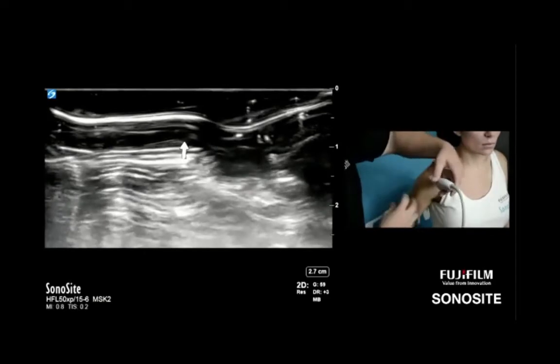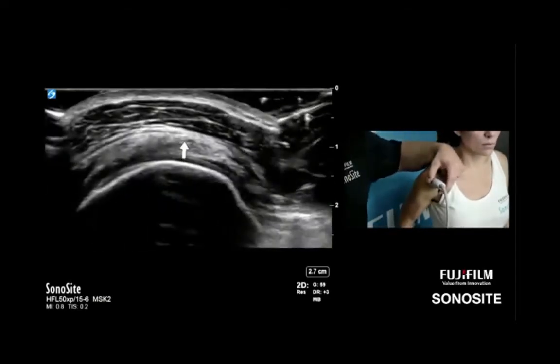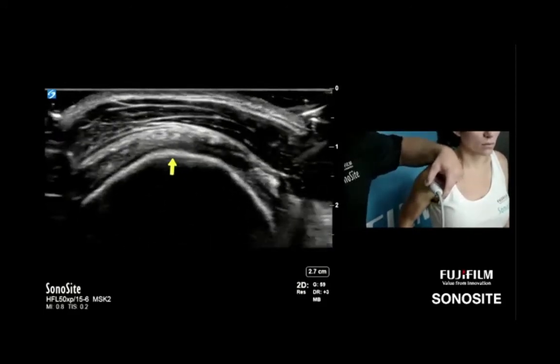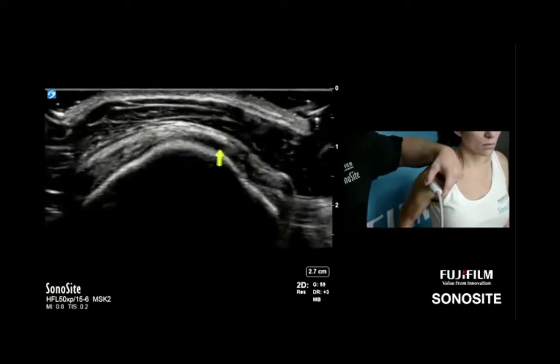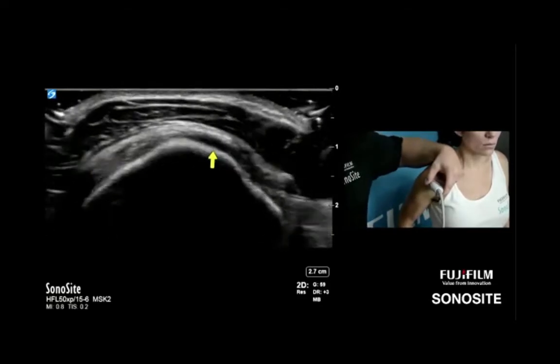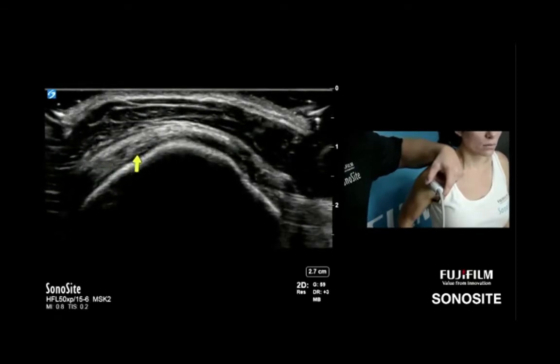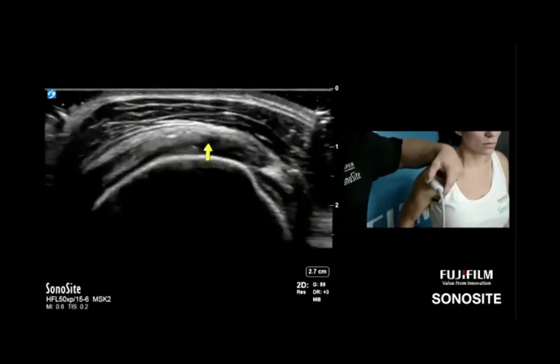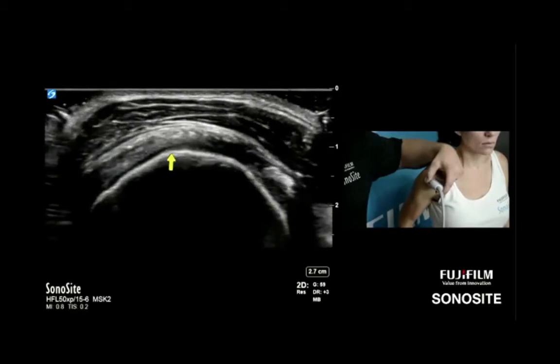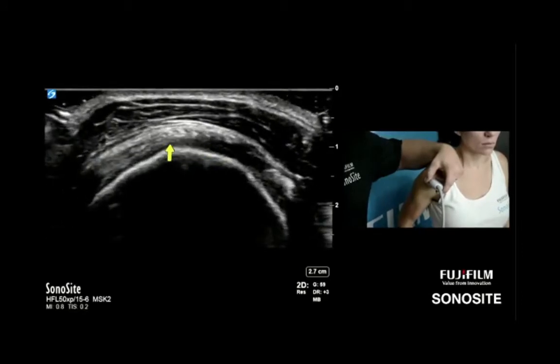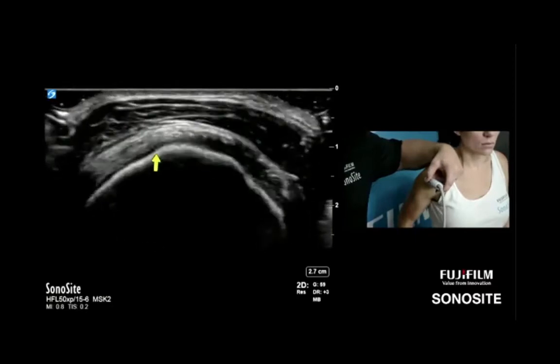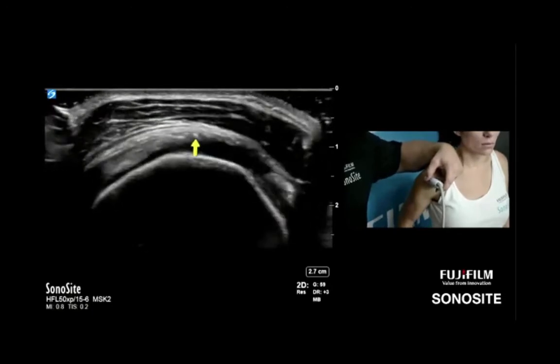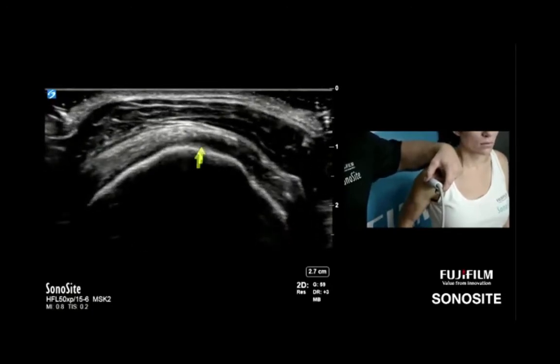There — I start to see the anterior or superior facet and then the middle facet making itself known. Adding a little gel and bringing the elbow back slightly to bring out more fibers. Here we are on the ball shape of the humeral head, falling laterally until I see that apex. Here's the anterior facet and middle facet. We can see infraspinatus and supraspinatus isolated. The division point: about one-third of the supraspinatus jumps to the middle facet, and the infraspinatus shares about one-third of its fibers jumping over to insert on about one-third of the anterior/superior facet.